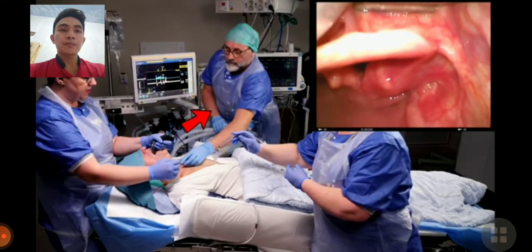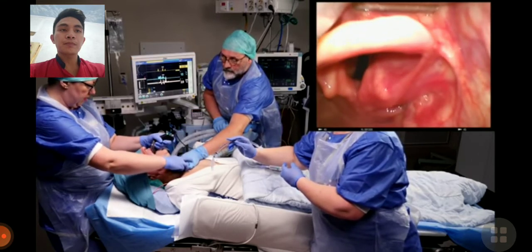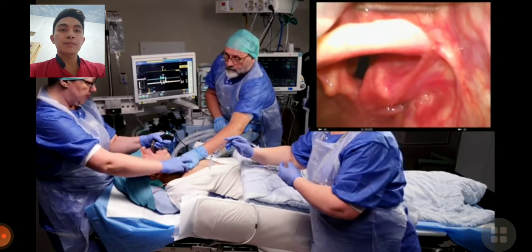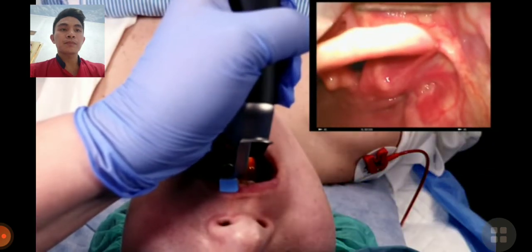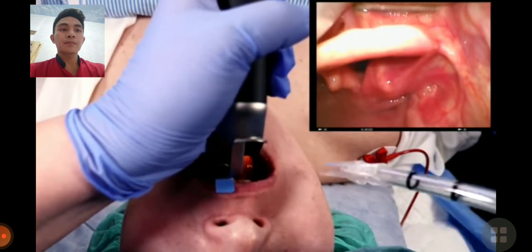Sometimes a light external force on the larynx can make the vocal cords spring into view. Ask for your assistant's hand and move it to apply backwards, upwards, rightward pressure, or BURP for short. Make sure you don't pinch the lips and do not exert any pressure on the front incisors.